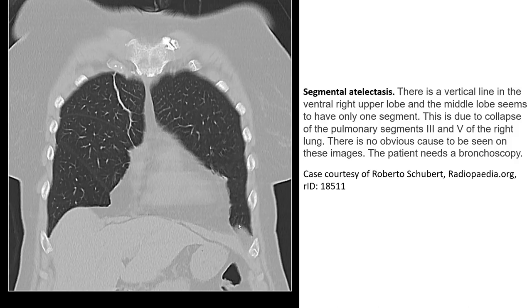Subsegmental atelectasis. On CT, a vertical line in the ventral right upper lobe and middle lobe seems to involve only one segment. It is due to collapse of pulmonary segments three and five of the right lung. There is no obvious cause seen on this image.